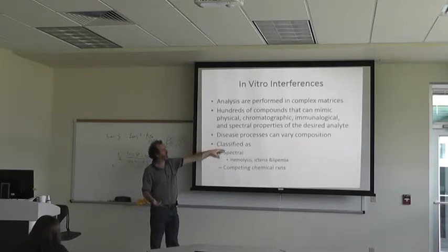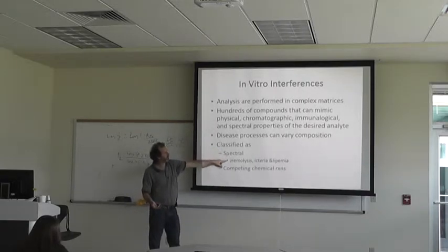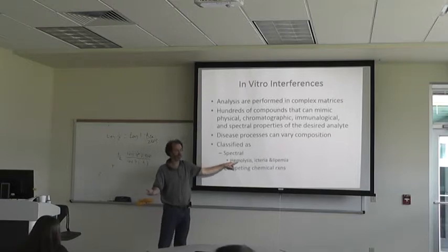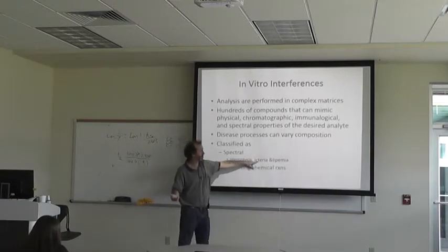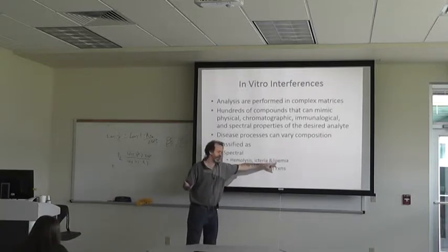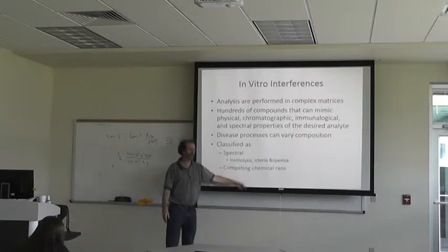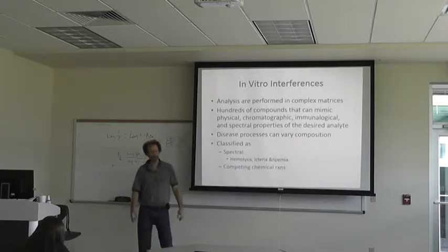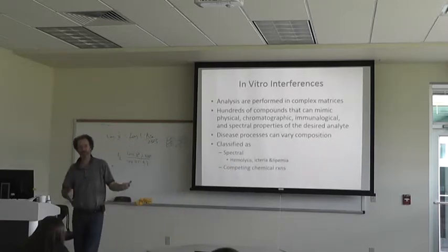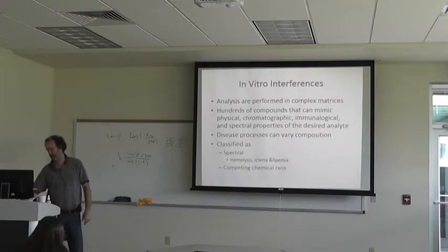They're classified as spectral interferences such as hemolysis — the heme is going to absorb light. Icteria is the bilirubin, and it's going to absorb light also. Or lipemia is going to scatter the light. Or you can have competing chemical reactions — an example is caffeine and theophylline, which will compete with each other for their antibody binding sites.